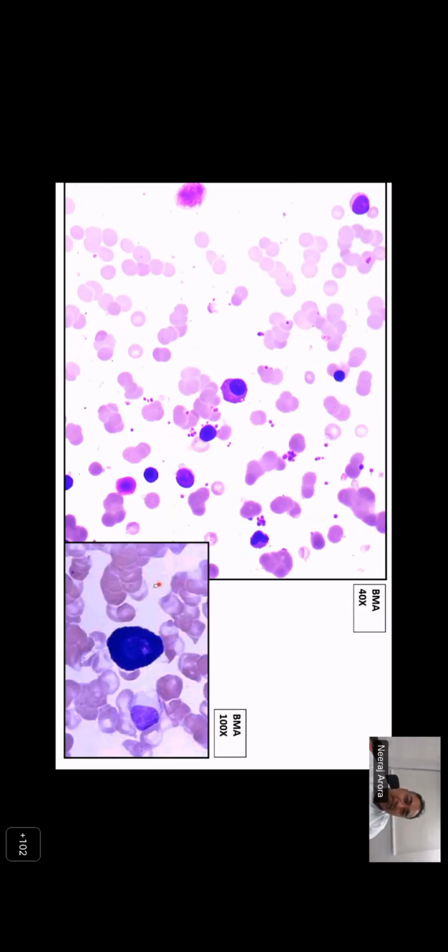So recognition of the mast cell is very important. In this particular case, whenever you are suspecting lymphoplasmacytic lymphoma, seeing mast cells tells me that I am dealing more with Waldenstrom's macroglobulinemia, with the history of hyperviscosity syndrome. Then you have IgM being documented, and I am seeing lymphoplasmacytoid cells along with mast cells. It is enough for me to suspect that this is likely a lymphoplasmacytic lymphoma. If possible, flow needs to be done in this particular case. It was dilute, so we went back to the characterization on the bone marrow biopsy.